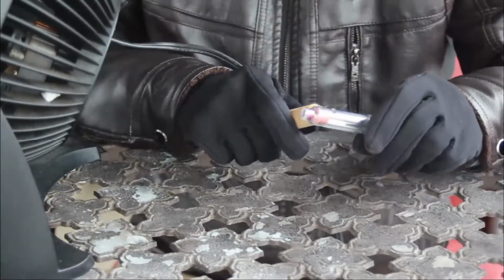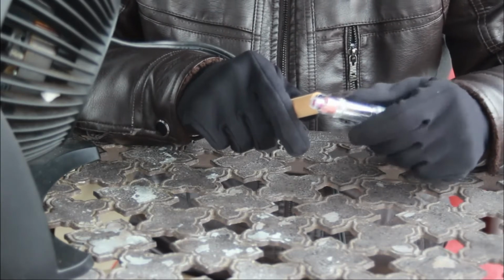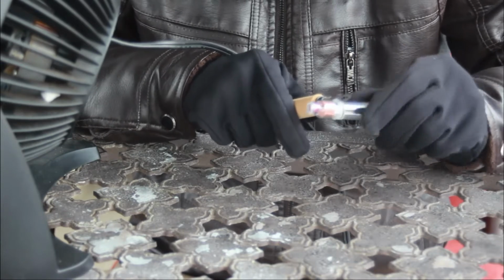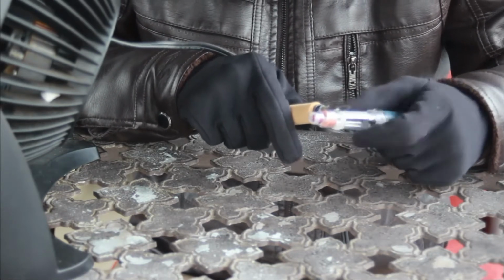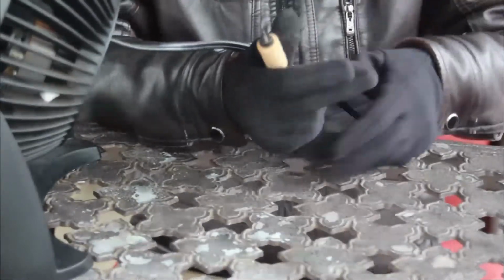So as you see, what I'm doing right now is I'm basically gently rolling the pen sideways while I have my knife's edge dragging on it in a line until it melts all the way through the plastic and is able to get the vial out.